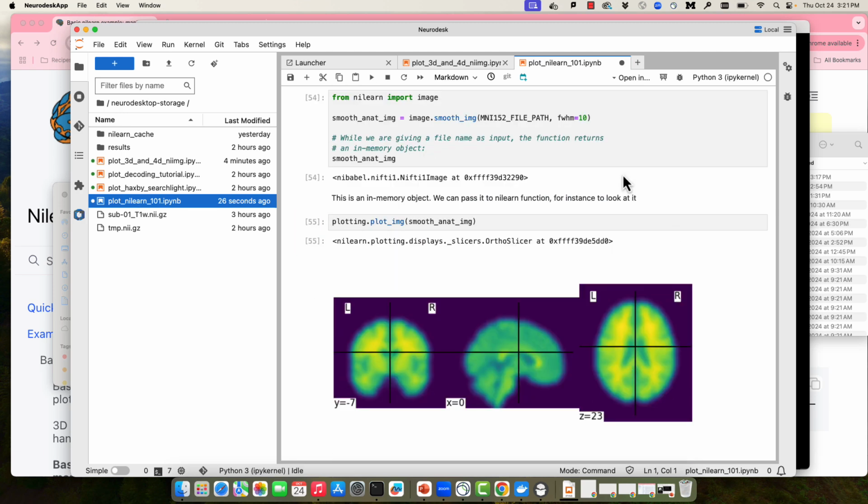So I'm just running those couple of cells. I'm not running the whole thing again, just those two. Again, that structure makes it very easy to debug and to change things locally. You'll notice that the output is going to look much blurrier because we used a larger smoothing kernel. So for those who are interested in using Nilearn for their entire preprocessing pipeline, you can use it for that, I believe. I know it can do modeling, it can do these basic preprocessing steps. Nothing's stopping you, really.